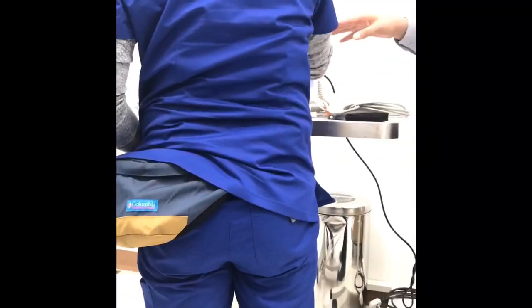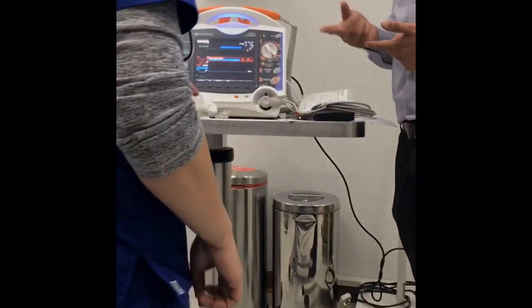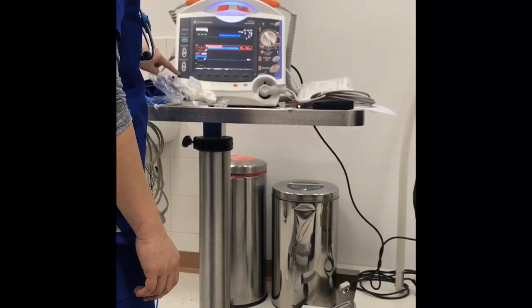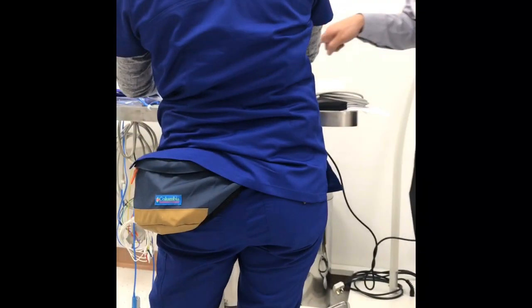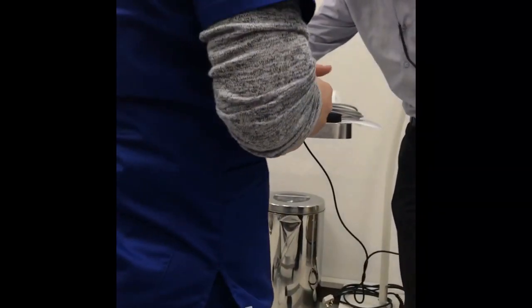Pacing output, milliampere, it's mentioned here. This is pulse per minute. So fixed means regardless of the BPM, the machine is still giving current. Demand means according to the patient condition.